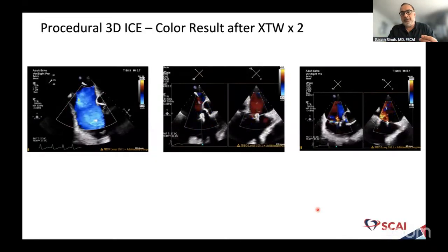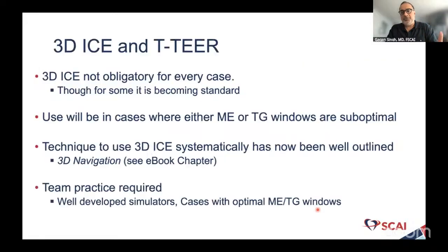And again, this could not have been completed without 3D ICE because our imaging windows were suboptimal. So I'll close with this, which is, I think there's a lot of debate about this, and the standard of care is relatively wide here.